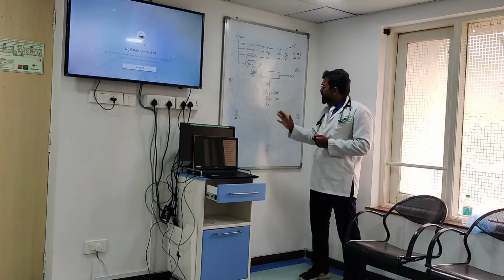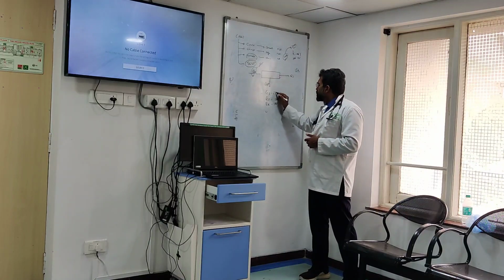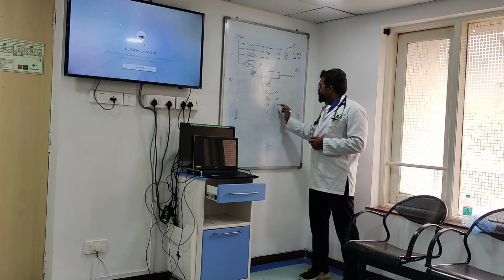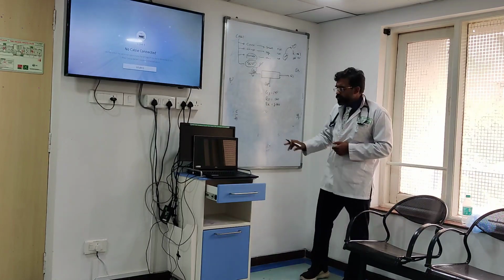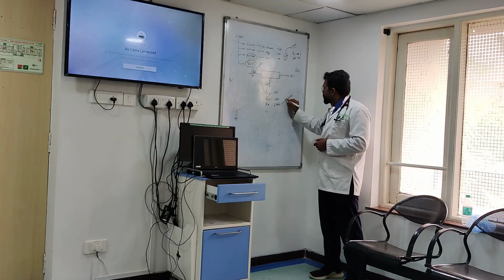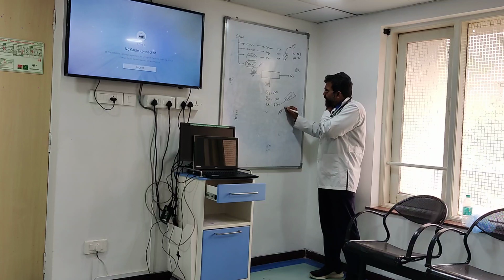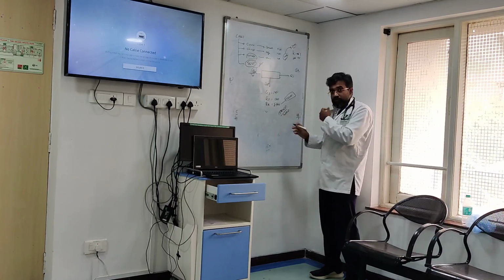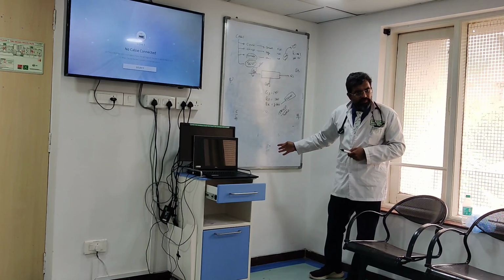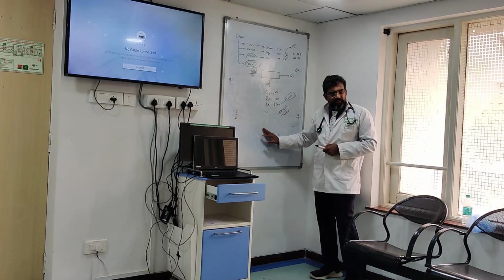You understand? And accordingly I'll keep my blood pump flow, which on an average if you keep 150, I have 9 liters. I know when I keep my blood pump at 150, I know my entire replacement is going to be, look at this, 6,000 or 2,000. So 2,000 into 6 is how much? 12,000. 12,000. 150 ml per minute, no? 150 into 60 is how much? I have a problem. Clear problem? Understood? You had kept 150 ml per minute? Is my dose right? Why?